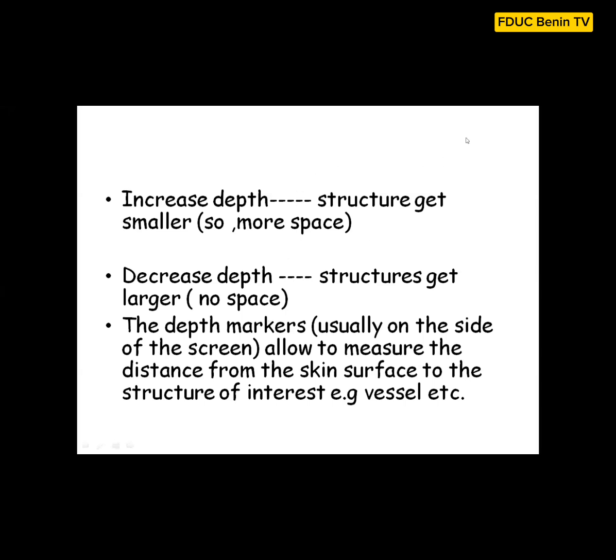And as I said, if you look at the screen, you will see the depth markers. They are usually on the side of the screen of your monitor. You will see them increasing and decreasing. Initially, you will just be moving it, but you will see the numerical value on the screen.